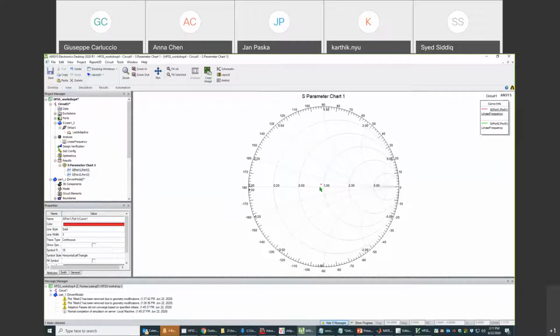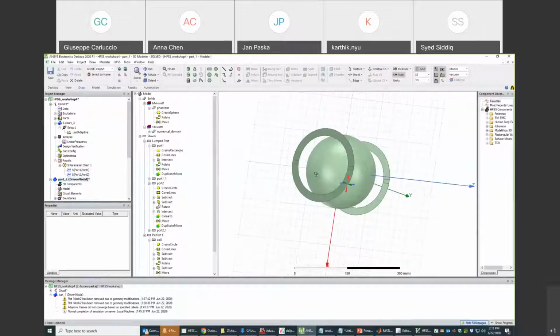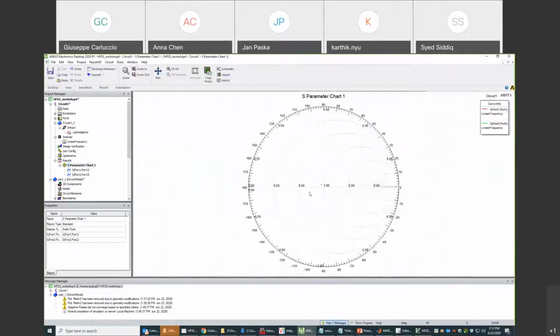So yeah, as I said last time, this can also be done without co-simulation, but you would have to make like 50 simulations to figure out the proper value of the tuning capacitor and the matching capacitor. But if we replace the capacitors with excitation ports, we can have variable capacitors instead and do this process of tuning and matching in co-simulation. And yeah, we can match the coil in this way. So yeah, that's the co-simulation part of the array.